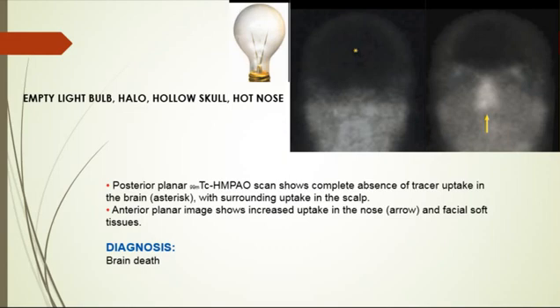If the diagnosis is unclear, a nuclear medicine brain scan can be performed using technetium, with different ligands linked with technetium. These agents are lipophilic agents that selectively cross the blood-brain barrier and are taken up by the brain parenchyma. The initial dynamic flow images are acquired in the anterior projection, followed by delayed static blood pool images in the anterior, posterior, or lateral projections. Brain death is diagnosed when there is complete absence of tracer uptake within the cranium on all images.